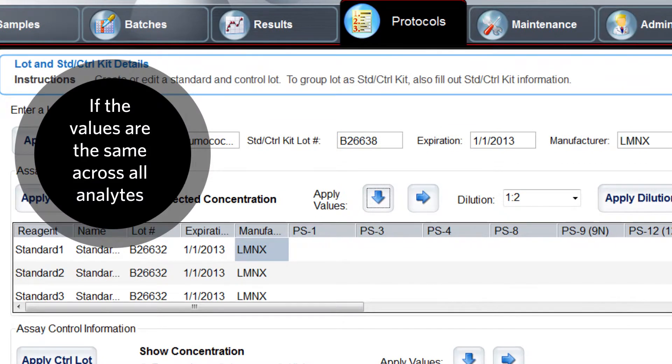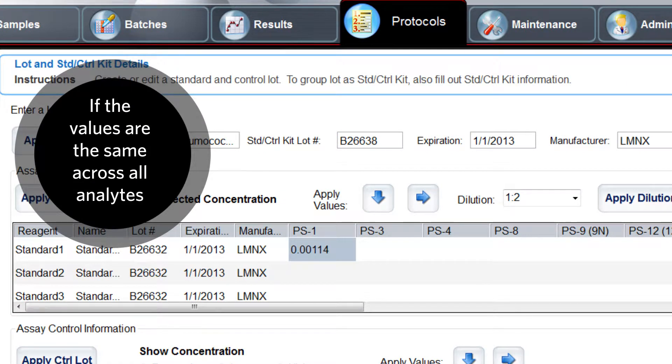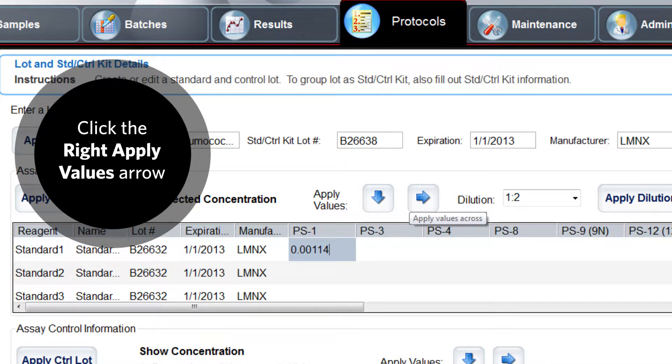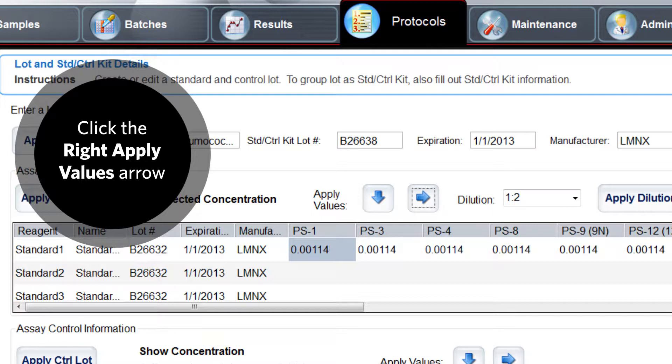If the values are the same across all analytes, you can click the right apply values arrow to repeat the numbers across multiple fields.